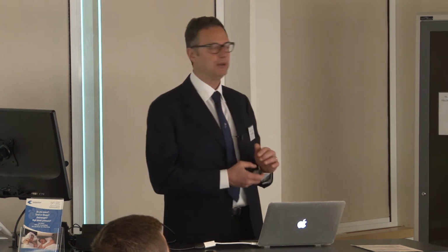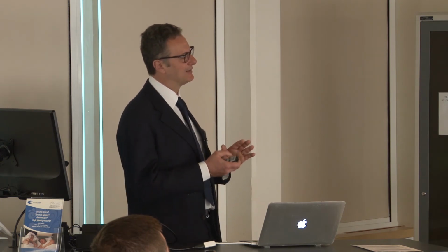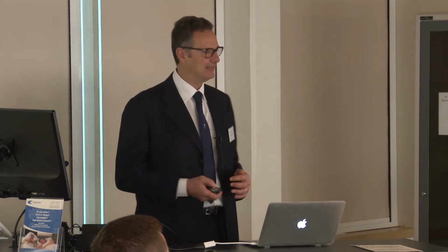So we remove completely the vocal ligament and also a very thin superficial part of the muscle, to be sure about the oncological radicality, because most of the invasive carcinomas are limited to the vocal ligament without infiltration of the vocal muscle. Of course, when you have some doubts, it's better to perform a deeper resection to be sure to have a clean margin in the histology report.